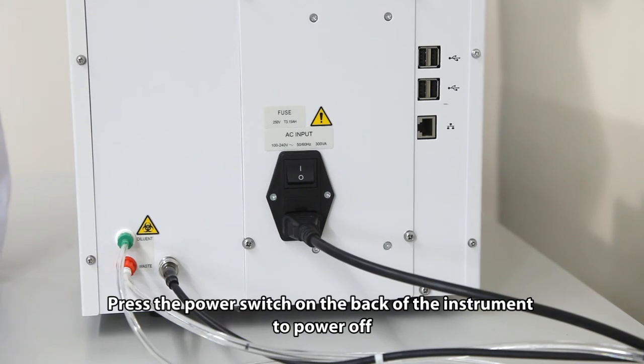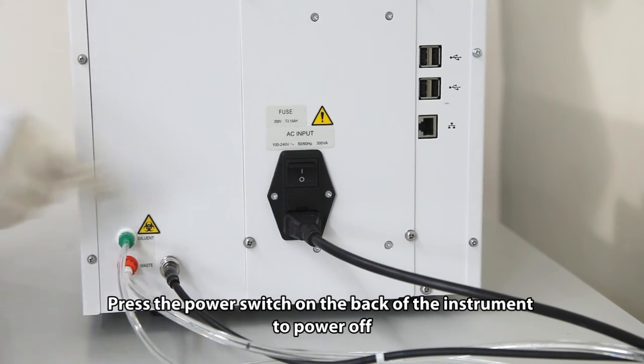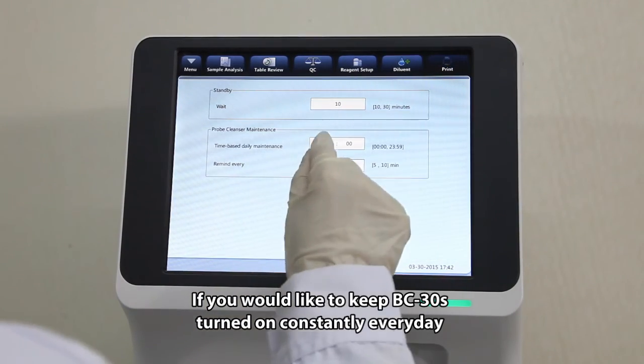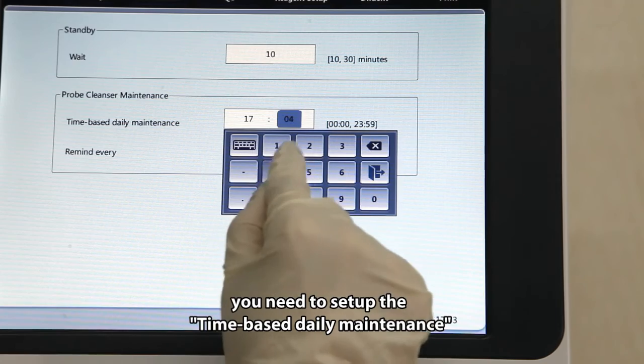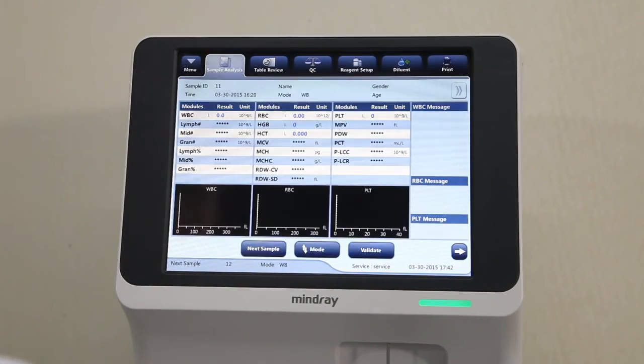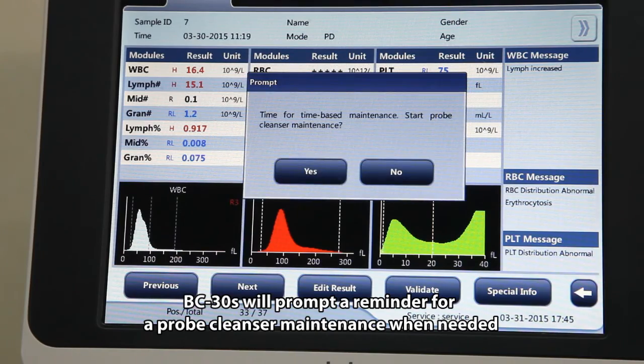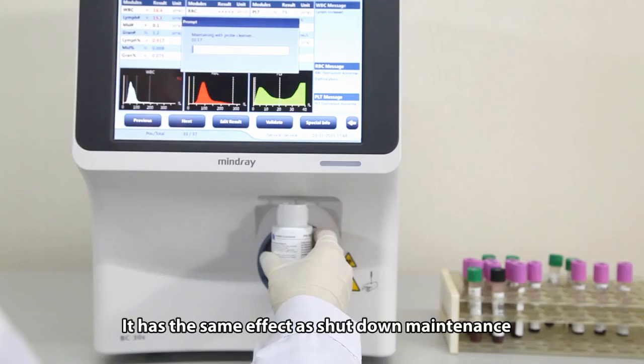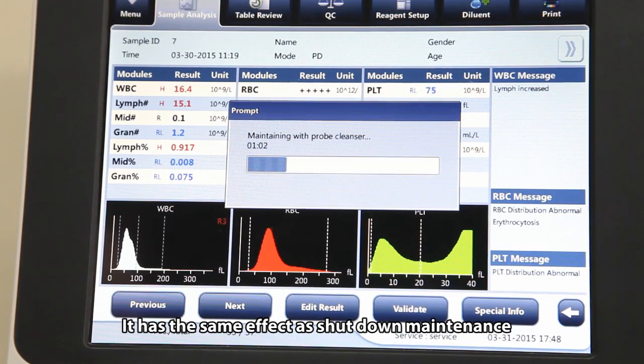If you would like to keep BC-30S turned on constantly every day, you need to set up the time-based daily maintenance. BC-30S will prompt a reminder for probe cleanser maintenance when needed. It has the same effect as shutdown maintenance.